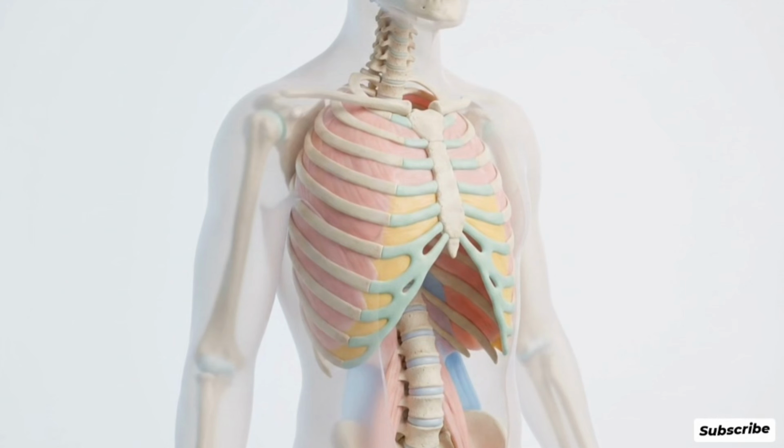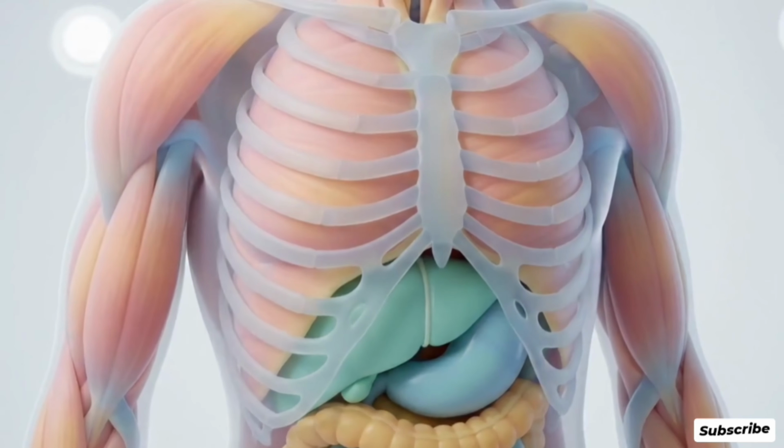If a doctor needs to see a fractured rib, they use an X-ray. Ionizing radiation passes through the body. Dense calcium blocks it, leaving a crisp shadow of the skeleton behind.